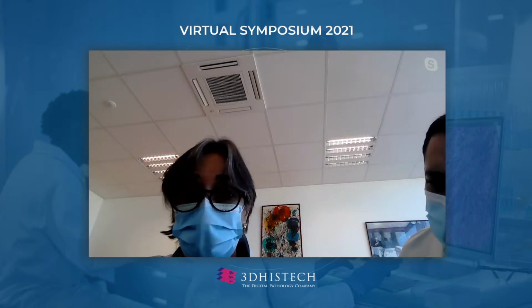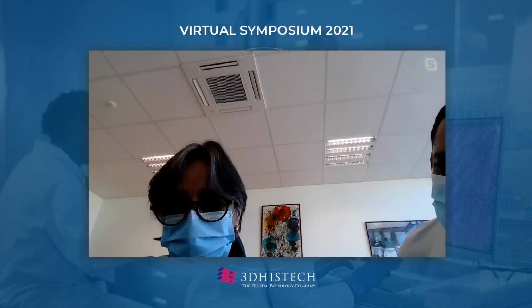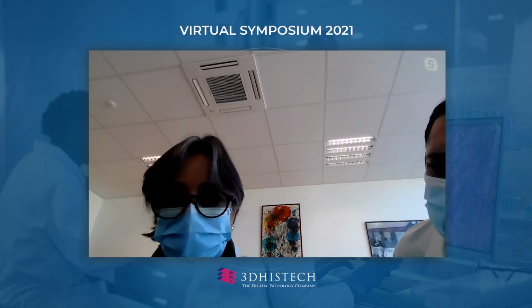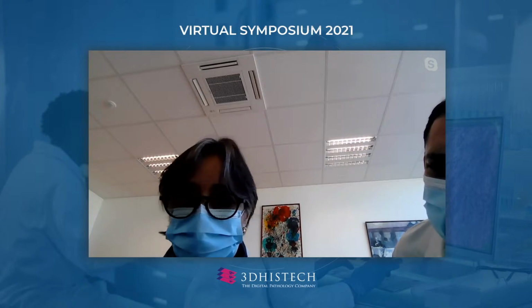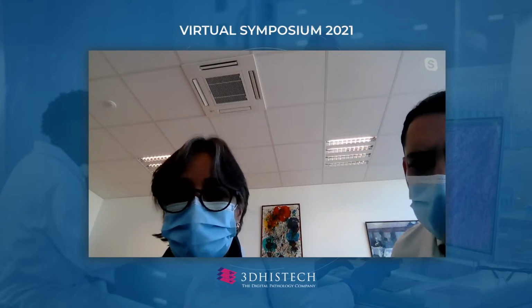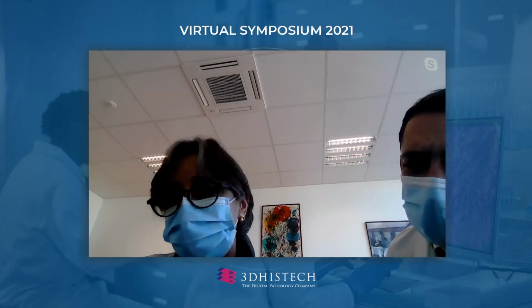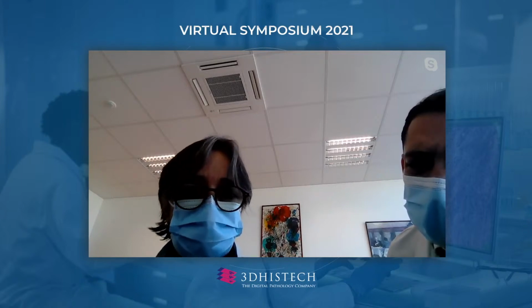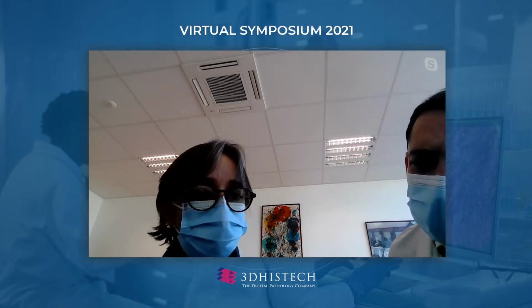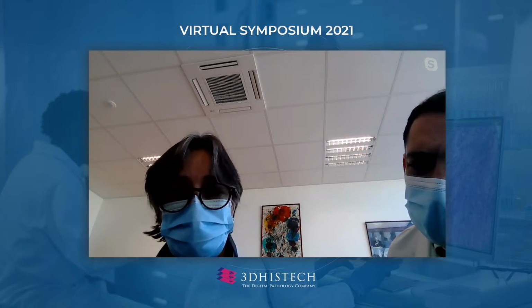That means that for a while, pathologists had both glass slides and digital slides, and probably this is helpful because each pathologist was able to validate the analysis of digital slides when comparing to the glass slides, and I think it was a good solution to have a smooth and easy transition.